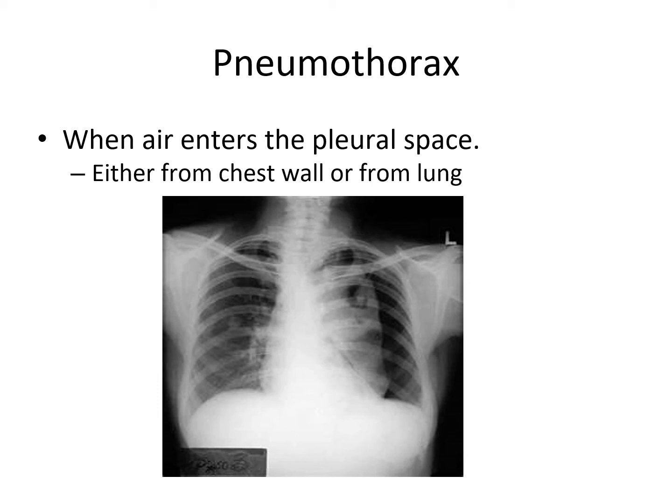So here's kind of like the border. So all this black area is collapsed. It's all collapsed lung. Okay. I should erase that. So there's your border right there. And then again, the dark area would be the pneumothorax itself, where it's collapsed.